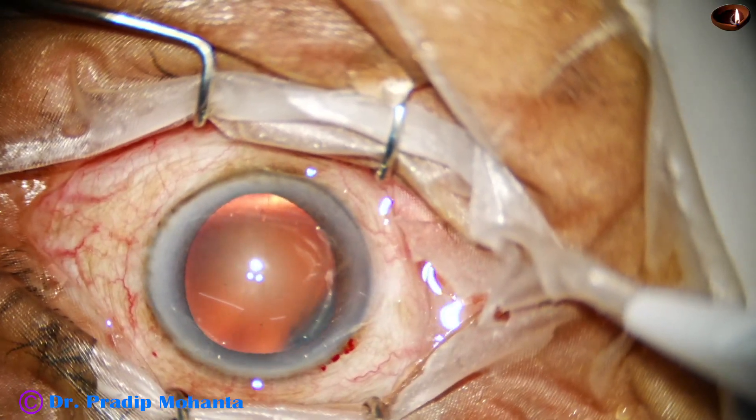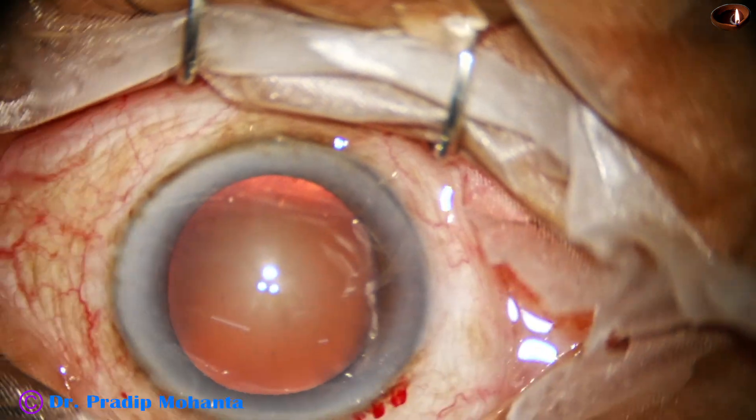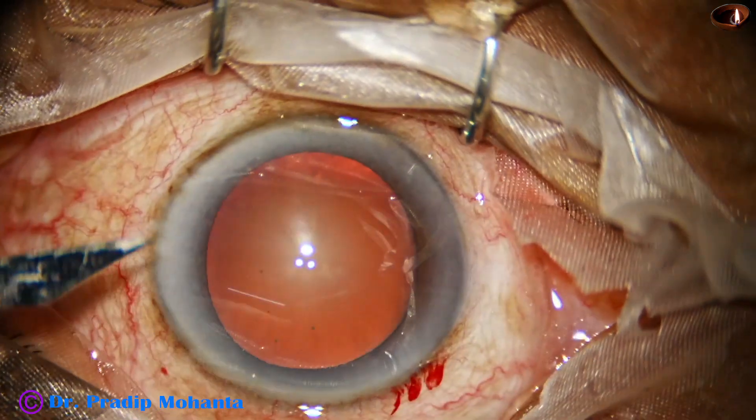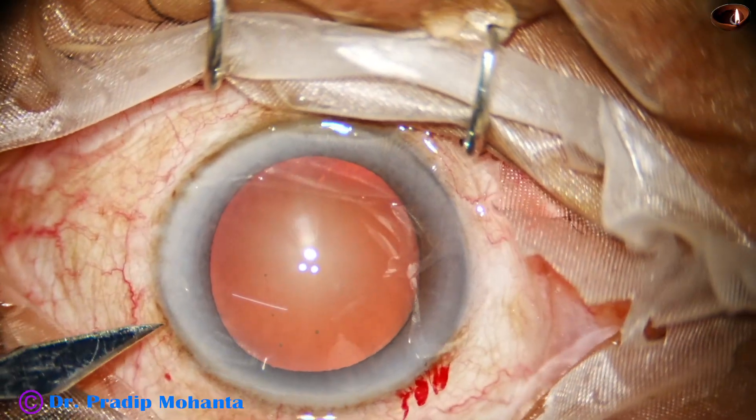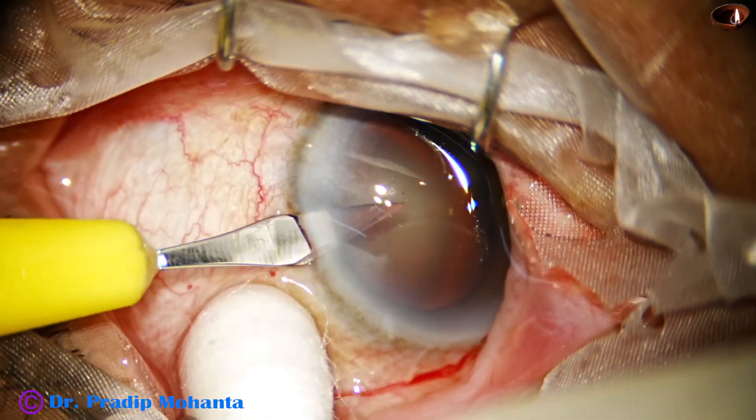A side port is made on the left side of the main incision with a lance tip knife. It is done.